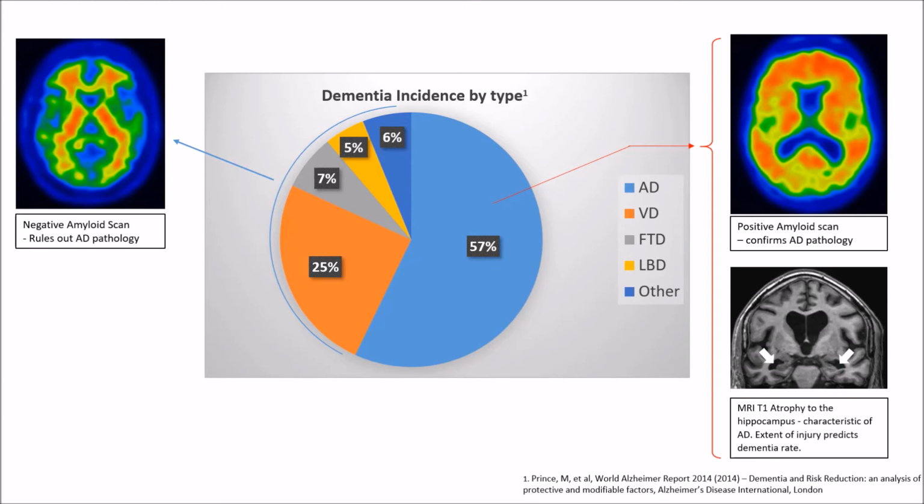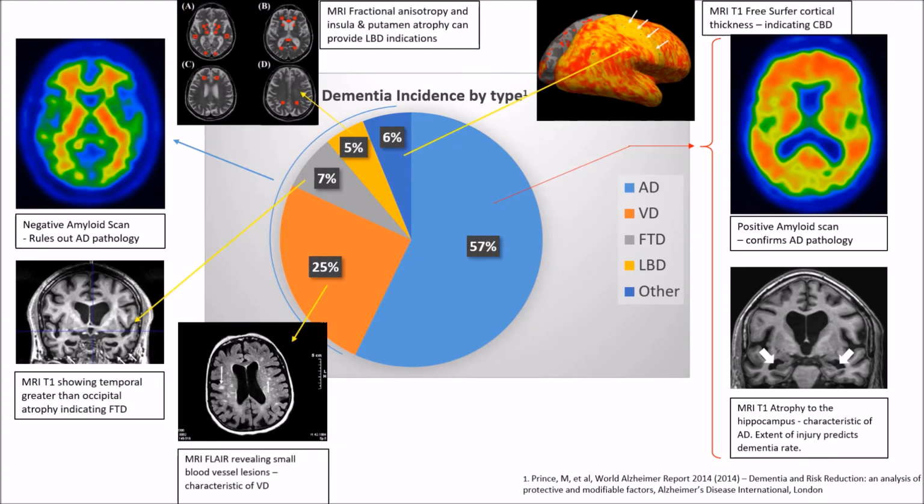In subjects whose PET scan is not amyloid positive, we can use different MRI biomarkers to get an understanding of what the underlying pathology might be. What we have done is develop an app that automatically extracts biomarkers and compares them against cognitively normal age-matched values, and then synthesizes that information in the form of a concise clinical style report.